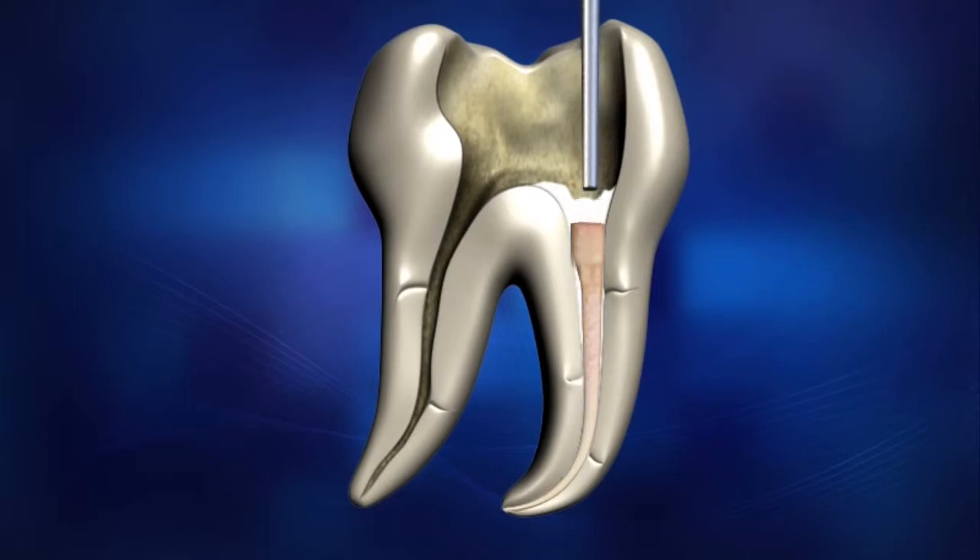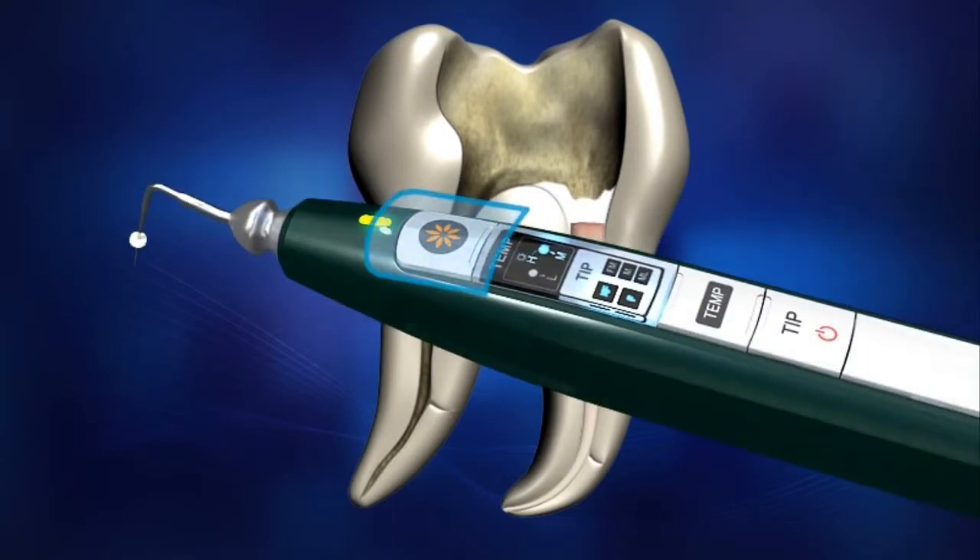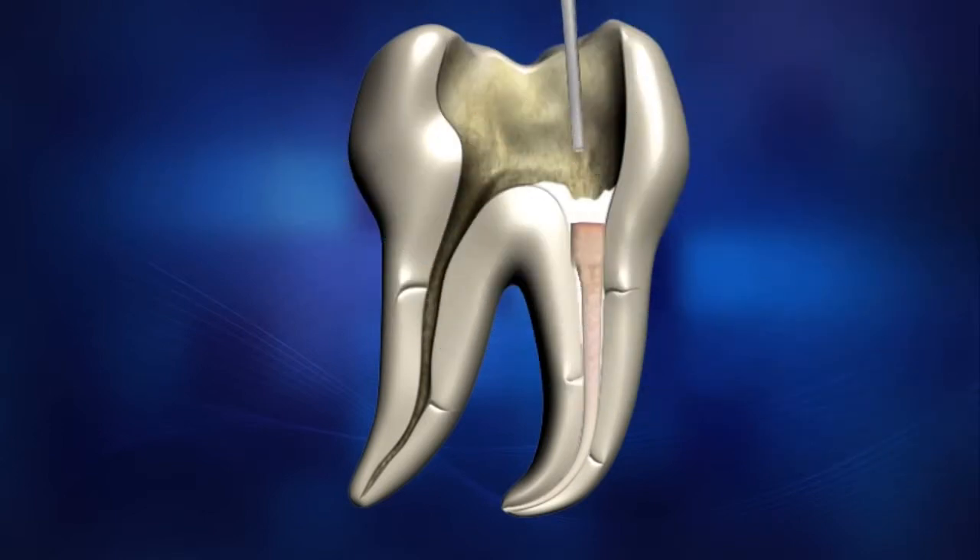Place the endo stop on the pen tip 1 millimeter shorter than the pre-measured working length. Insert and advance the heated pen tip to condense the Gutta-Percha to within 3 to 4 millimeters of the binding point. Softened Gutta-Percha cone material will fill the root canal. Release the operation button, then push and hold the cooled pen tip. Packing down and applying pressure to the melted Gutta-Percha ensures all the lateral and accessory canals are filled.